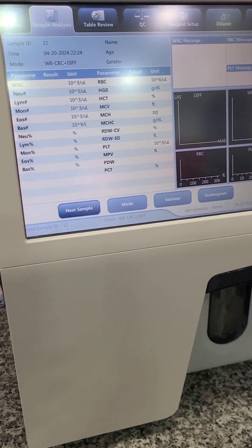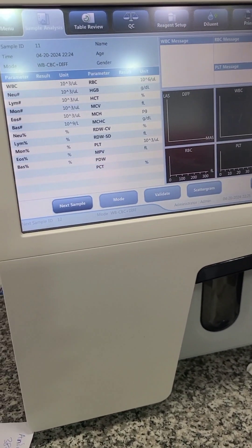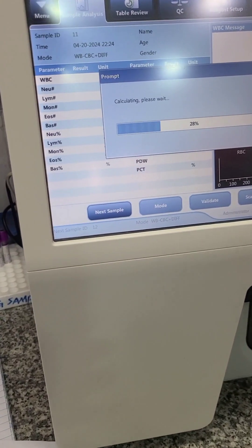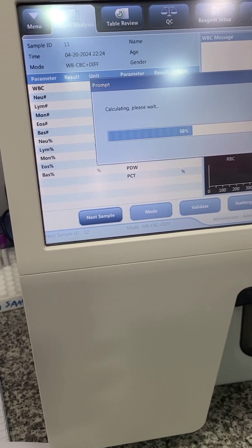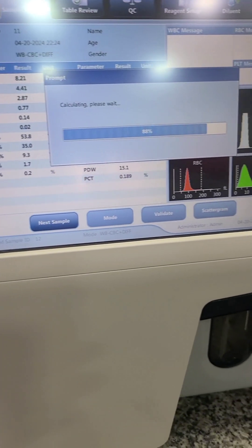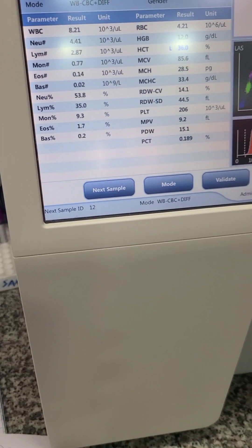This is a full blood count machine — a hematology machine. This one is a Mindray product, the BC-5000; there are different products depending on the company. This machine is used for full blood count or complete blood count. When you pass a blood sample through it, it brings out results showing the quantity and quality of different parameters and components of the blood — the red blood cells, white blood cells, and platelets.